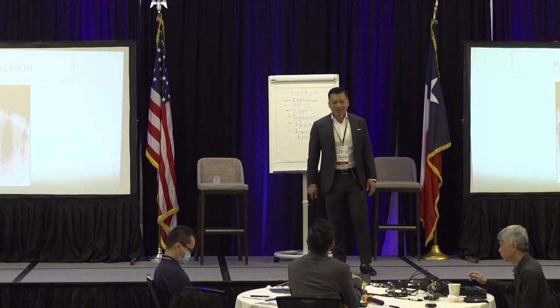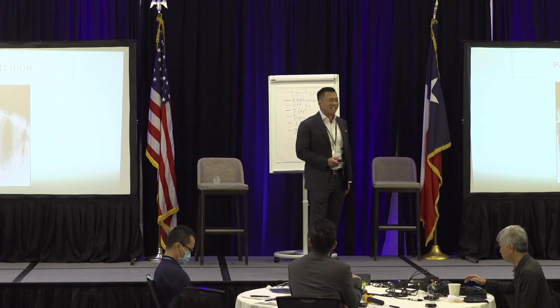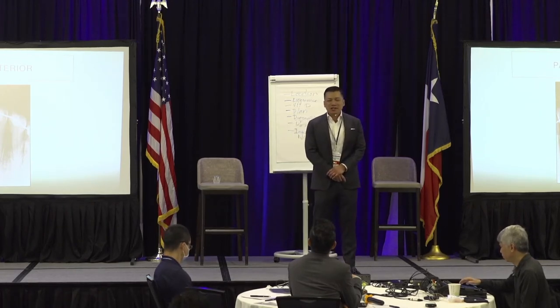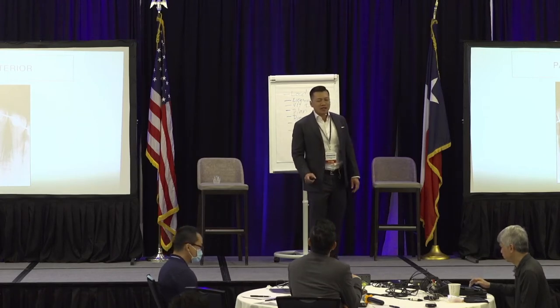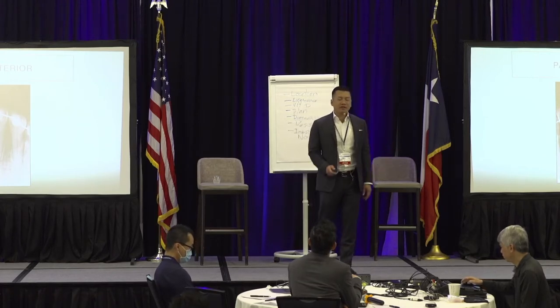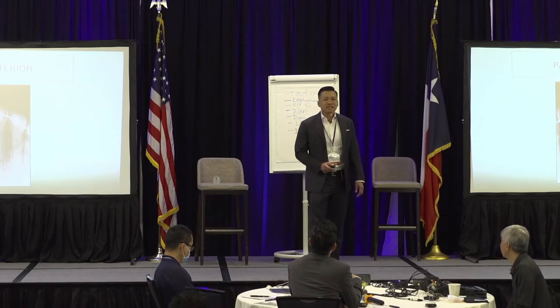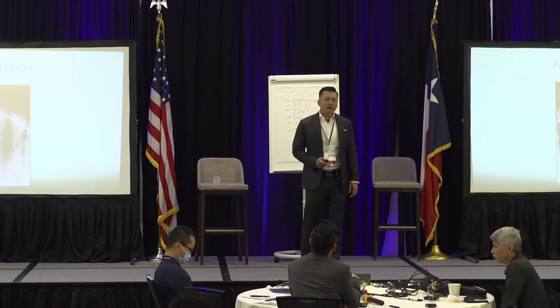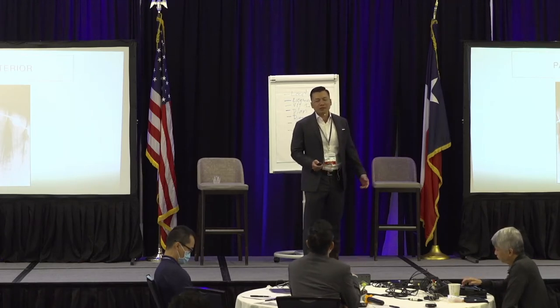But I added this case after Dr. Hornbrook. I disagreed with him. He's saying sometimes if there's no bone, you gotta do a bridge. Well, actually, this patient didn't want a bridge. A couple of doctors said, let's do a 22 to 27 bridge because there's no bone. You can see the teeth are splinted because they're very mobile, like grade 2, grade 3 mobility, perio involved. So, you know, most people say take it out. But the patient says, I don't want a bridge. So he got referred to me.